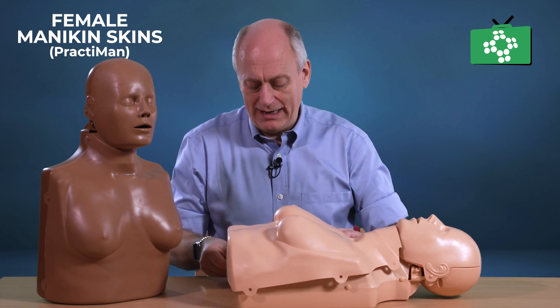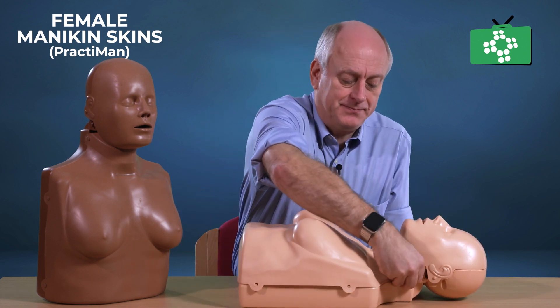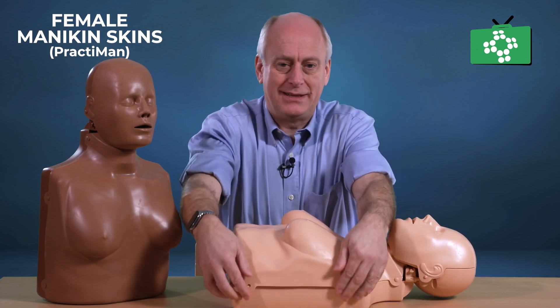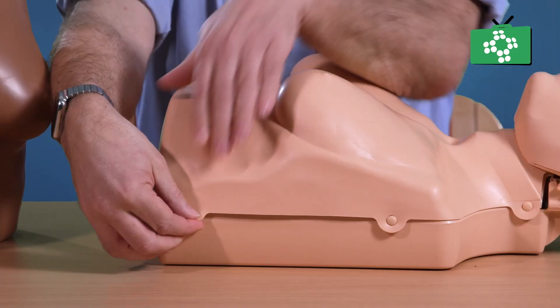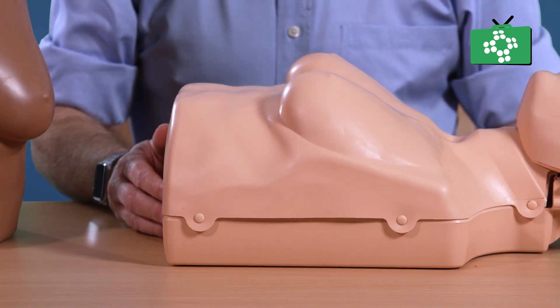Just make sure the lungs are set up correctly. Then all you do is clip in the corners, tilt the head back to put the neck clips on, and on this side just make sure that they're fastened on all the points, and then the mannequin is ready to use.